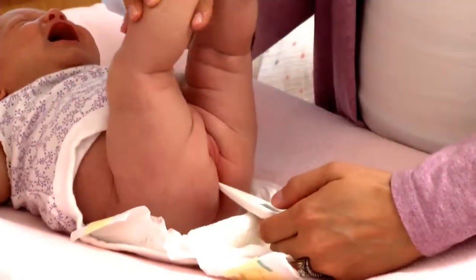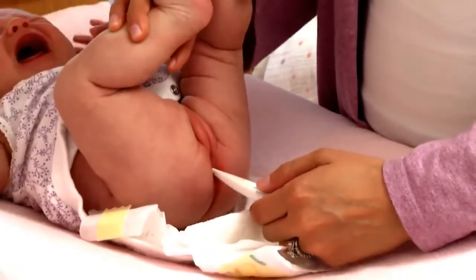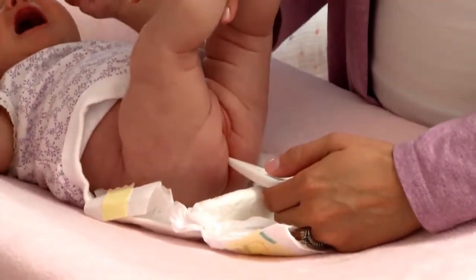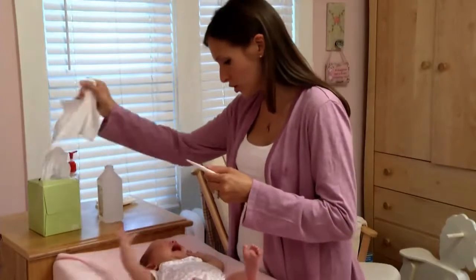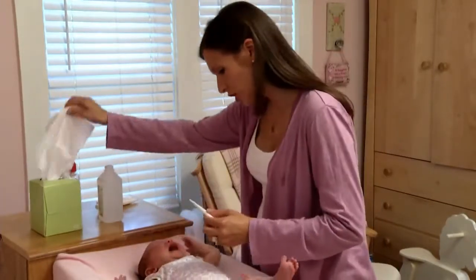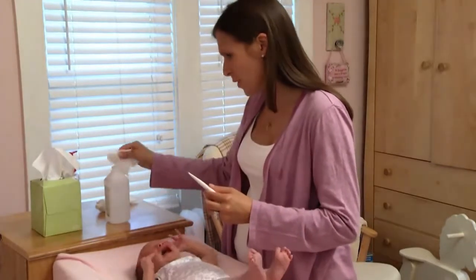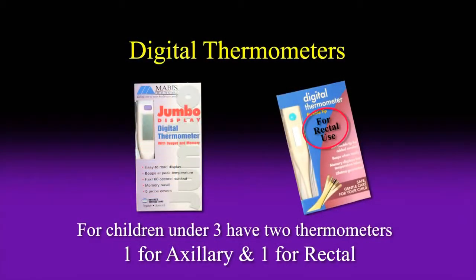Do not insert it more than one inch. Hold the thermometer in place, loosely holding the baby's legs. Keep it there until you hear the beep, about a minute. Then remove it and check the digital reading on the display. Clean the thermometer after each use — wipe it with tissue and then with rubbing alcohol or soap and water. Dry the thermometer before putting it away. It is a good idea to mark this thermometer for rectal use so you don't use it anywhere else.